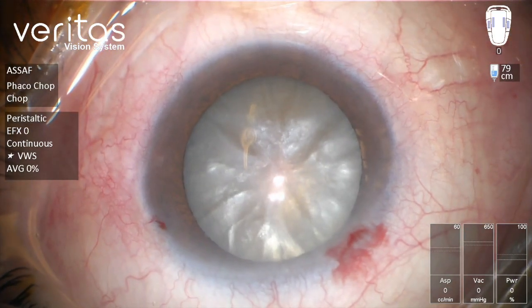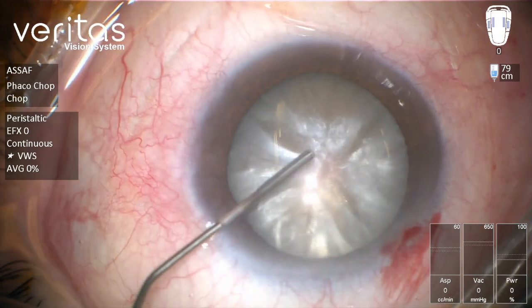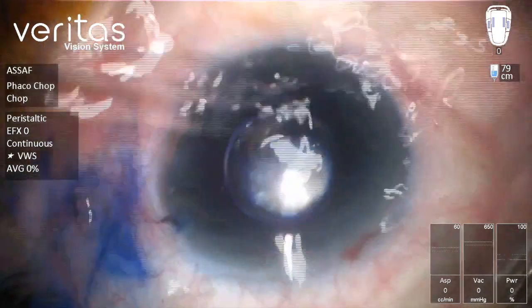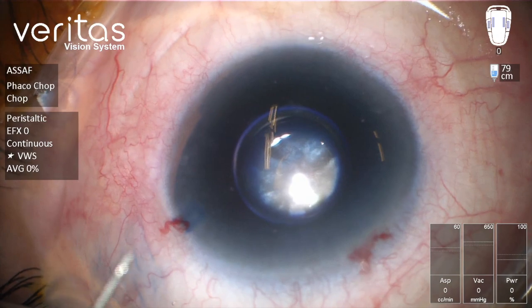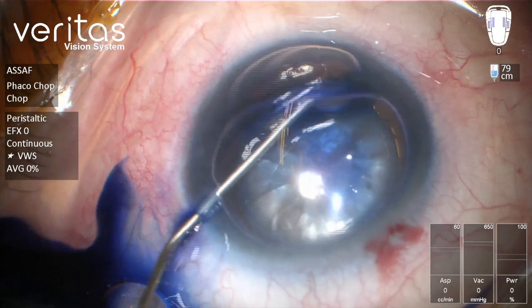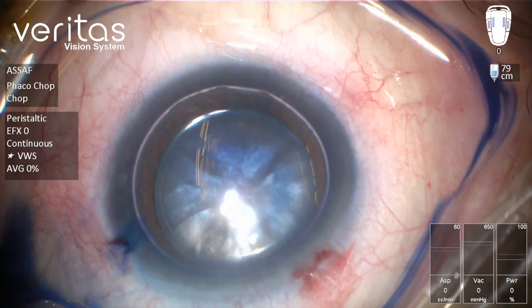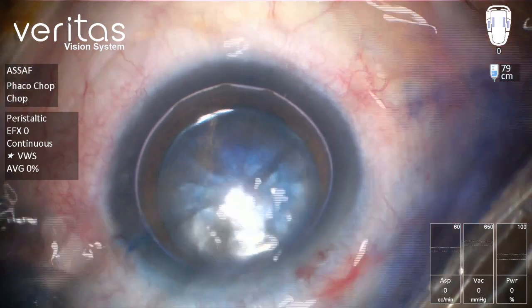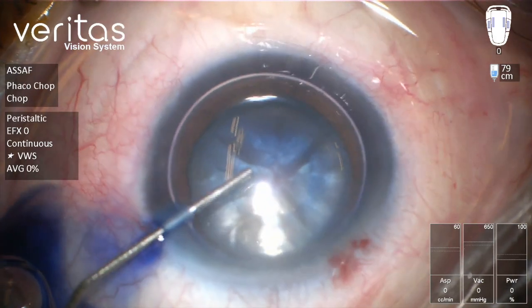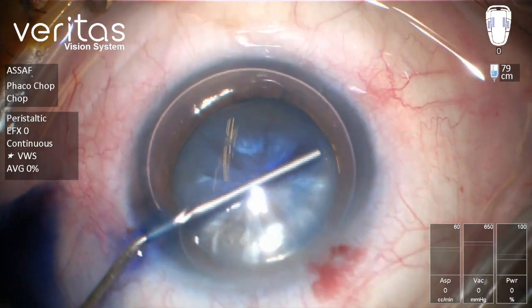Now we're going to inject stain into the anterior chamber to stain the anterior capsule. Here, as you'll notice, I'm injecting air through the side port, counting on the self-seal configuration of the main incision, so we can inject more stain on the anterior capsule to get a more or less even stain on the anterior surface of the capsule.